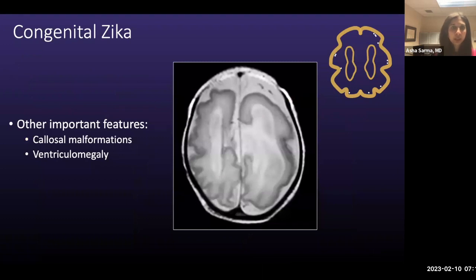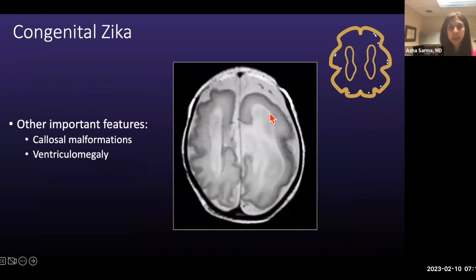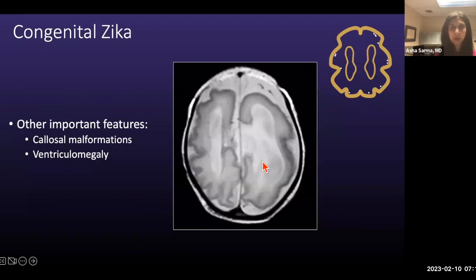Other important features of congenital Zika virus infection include callosal malformation. Here is a patient with a parallel orientation of the ventricles — typical of agenesis of the corpus callosum — as well as ventriculomegaly.